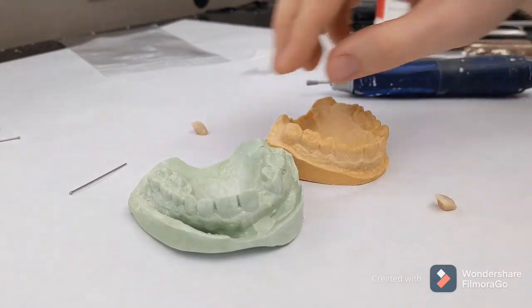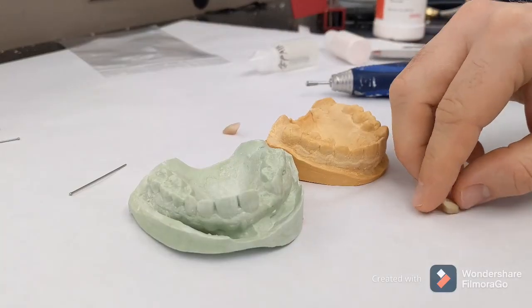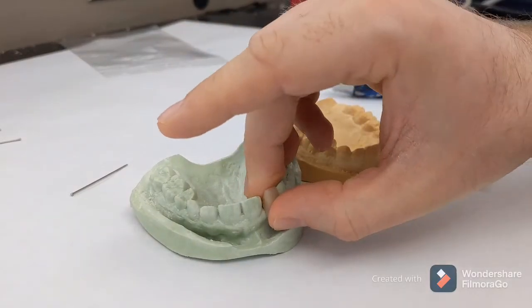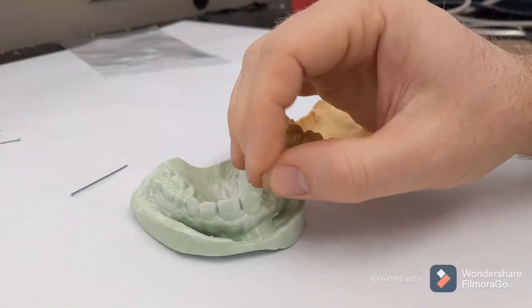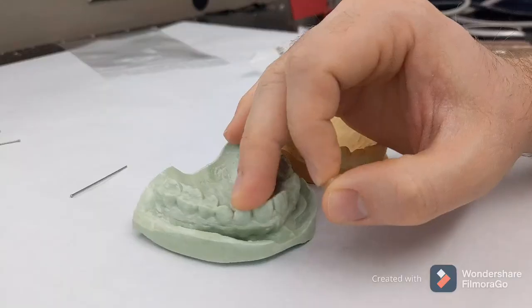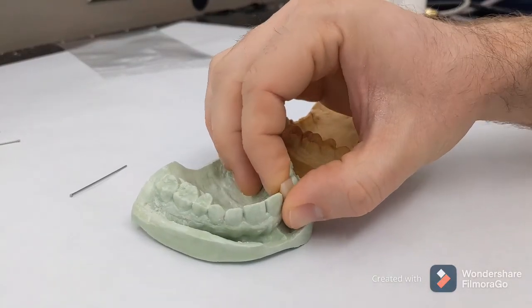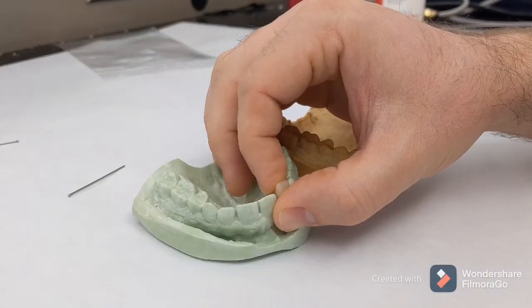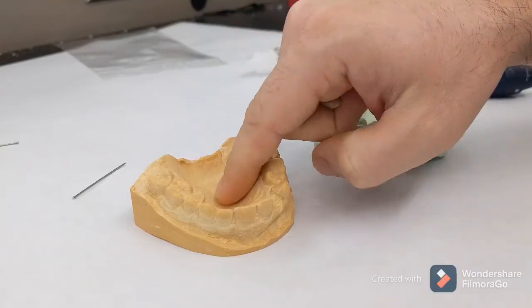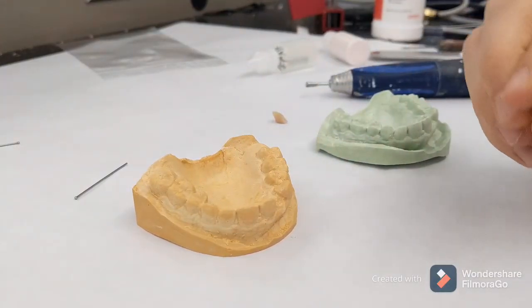We are going to make a flipper today to replace number seven. Number seven is a little wide, so we couldn't find a lateral that's wide enough. So what we're going to do is use a central in the shade that we like and make it look like number ten by rounding it out and doing a couple things to it. We duplicated the cast, because when you're making your flipper sometimes it'll break.